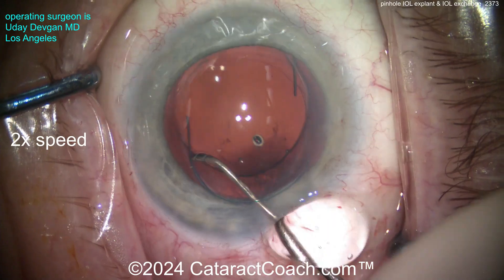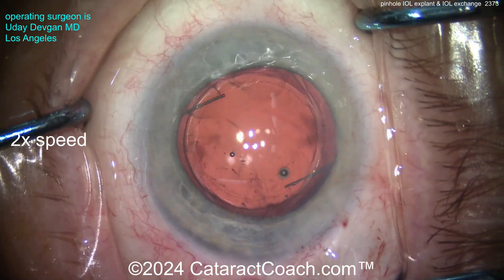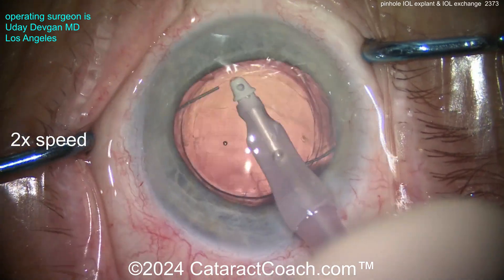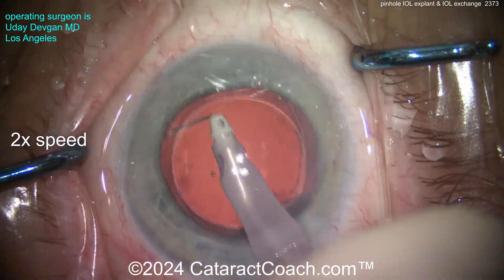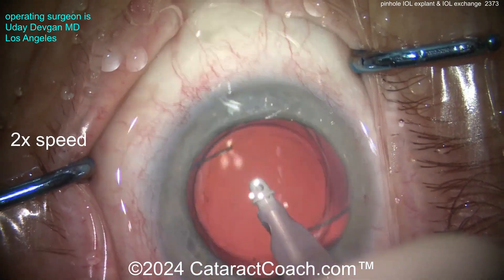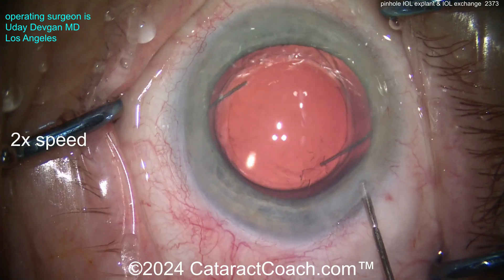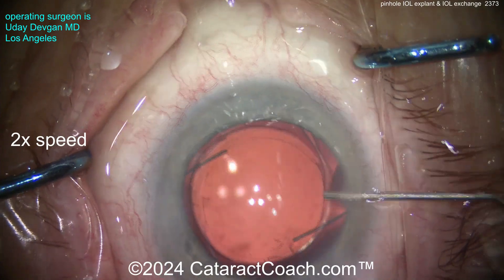The patient also complained of some negative dysphotopsias. Putting in this three-piece Bausch + Lomb LI61A silicone lens in the capsular bag is going to help minimize any post-op issues. It has a nice six-millimeter optic and the silicone material produces very little dysphotopsia. Taking out the viscoelastic carefully — you can see both haptics are in the capsular bag — that looks fantastic. So yes, these lenses are great for the right patients, but it's not a perfect lens for every patient, especially for patients who dilate outside the pinhole ring.